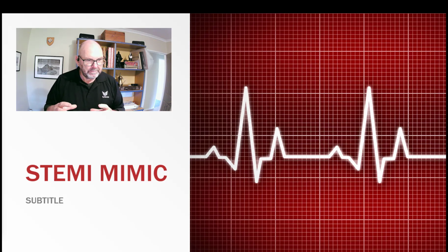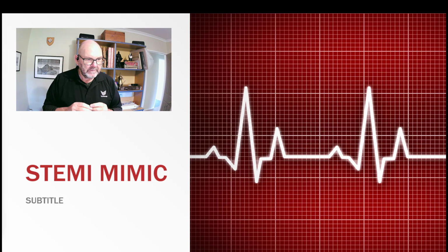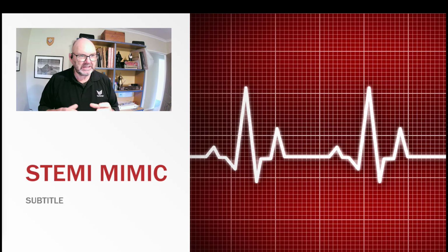One further recap. Regional ST segment elevation is caused by altered electrical potential due to damaged cells. So, it follows that anything else that alters the ion balance or produces an abnormal current in the heart will also produce ST segment elevation.